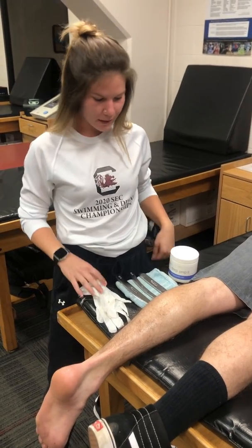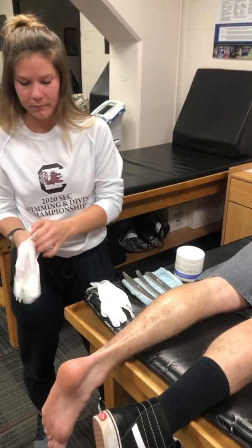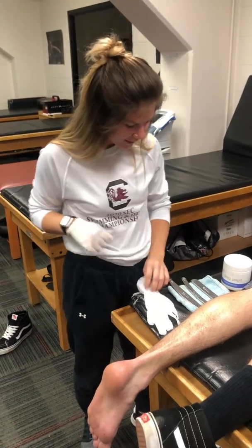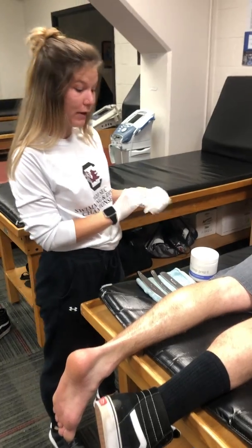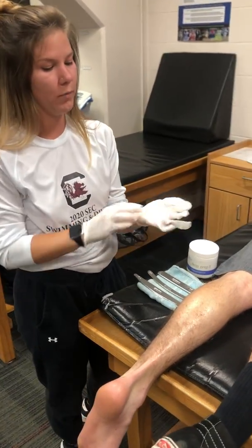Hi, my name is Maddie. I am a post-professional student at USC, and I will be showing you how to use GRASTON technique for an Achilles tendon. I'm going to first glove up. I've already put some emollient on my patient's calf — you can use cocoa butter or any spread that will help guide your tools a little bit easier.